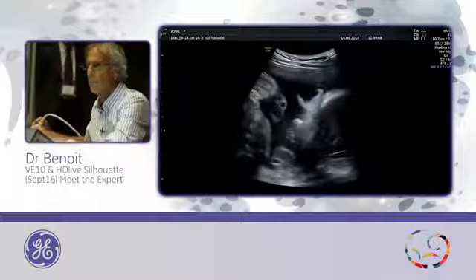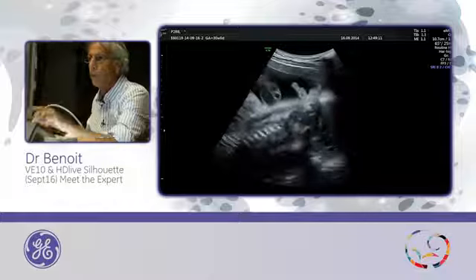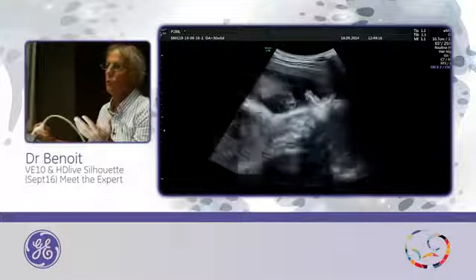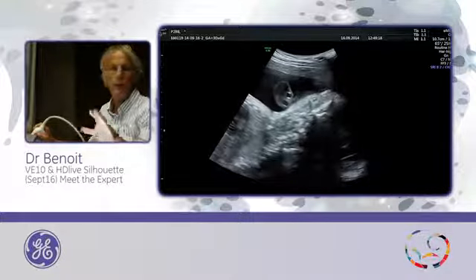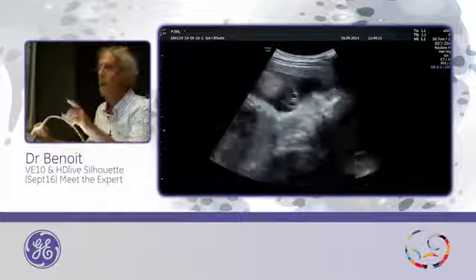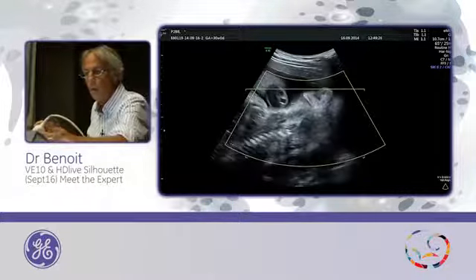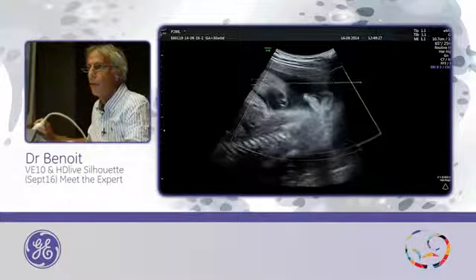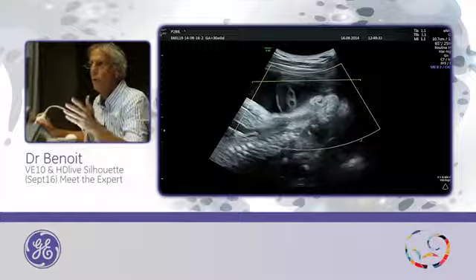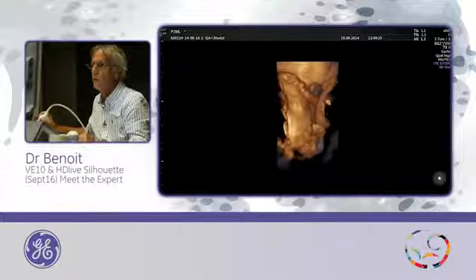And this is one ear. So I will start, when I do my 2D examination and also 3D, I am opportunistic. That means I do what I want to show the baby. So now you can see this is one ear. I can do just, this is one ear. We will try to obtain if the baby is not moving. The baby was moving, so it's not so good.